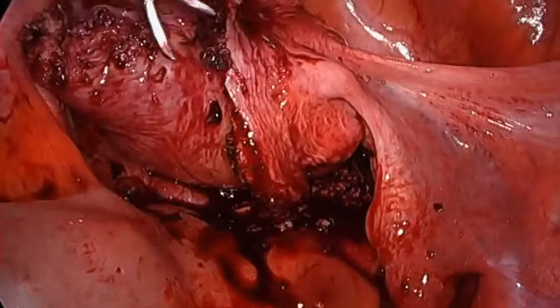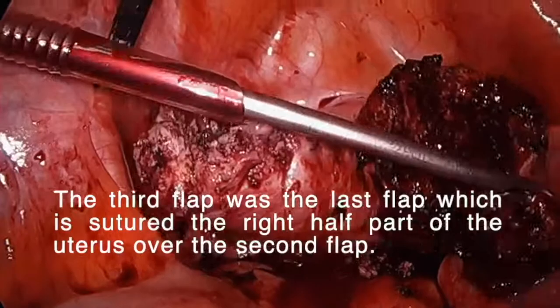The third flap was the last flap, which is sutured to the right half part of the uterus over the second flap.